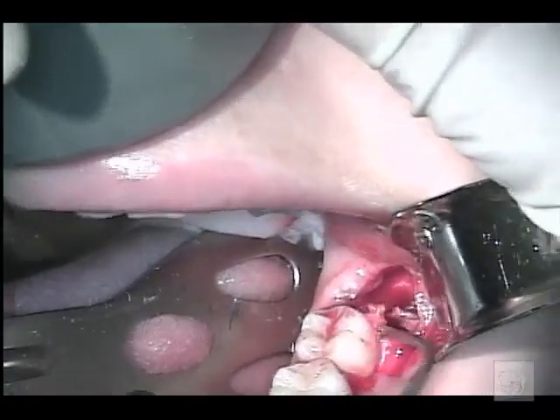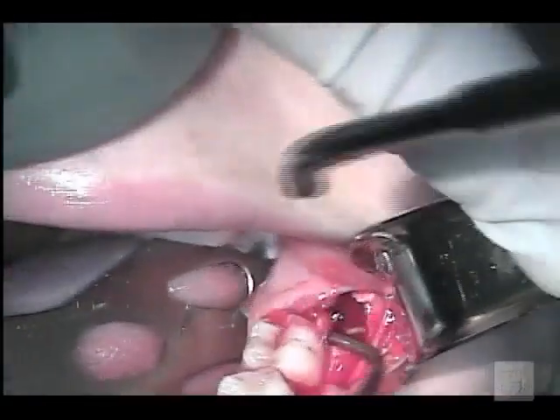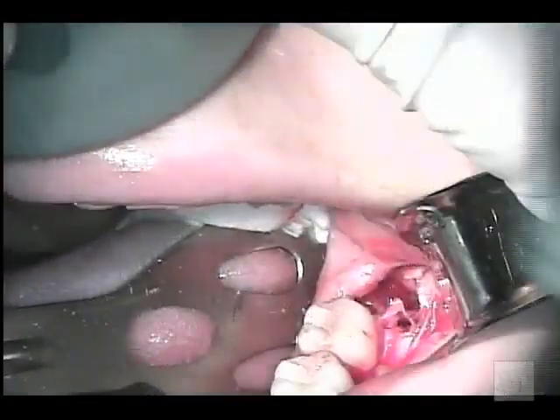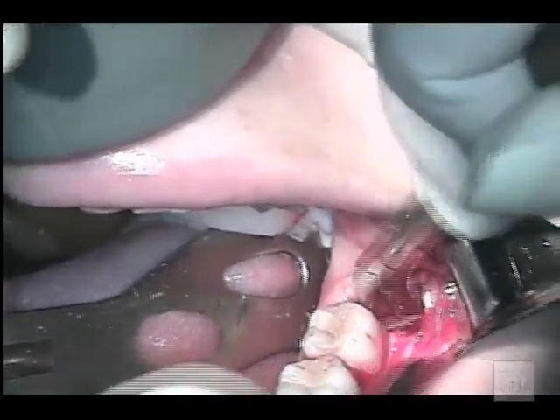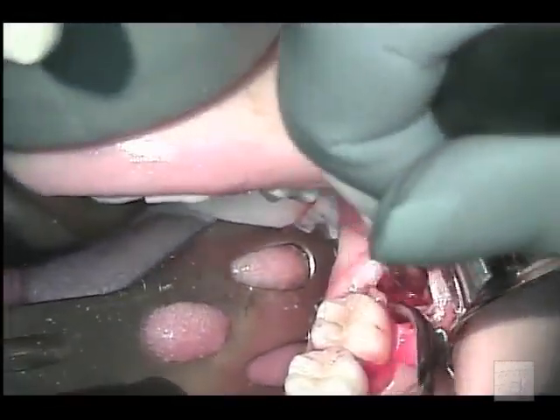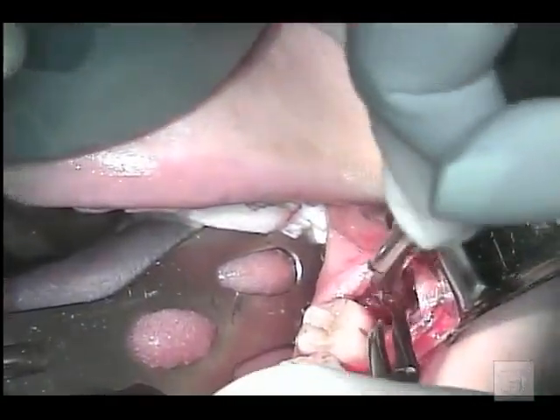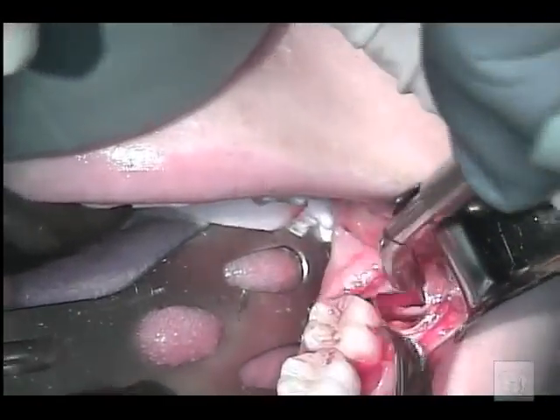It's also very important once the tooth is removed to remove all of the soft tissue and follicle from within the socket. If you leave follicular tissue there, it has a possibility of degenerating into a cyst should there be any inflammation back in that area anytime in the future. So you want to be sure to curette that out very thoroughly.